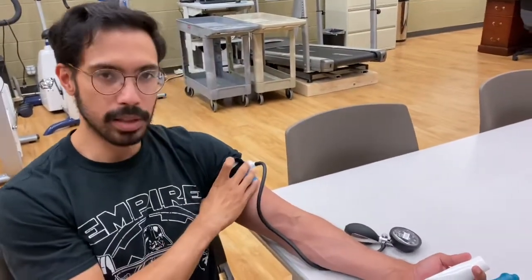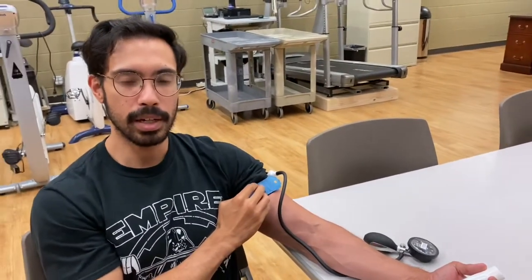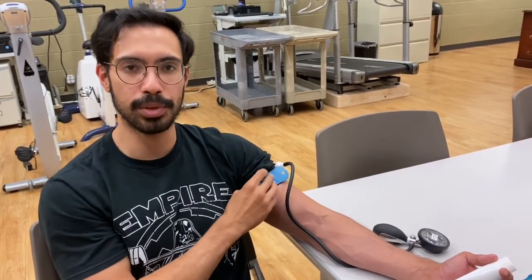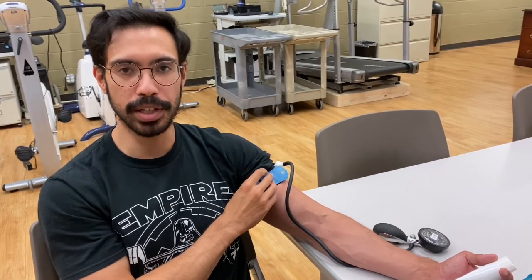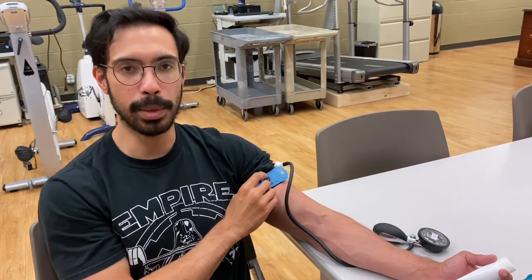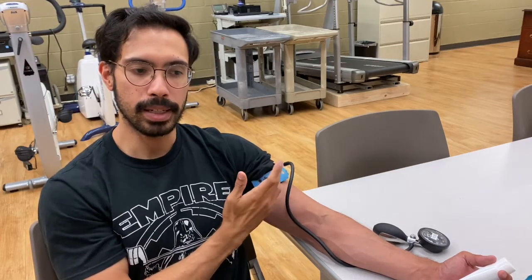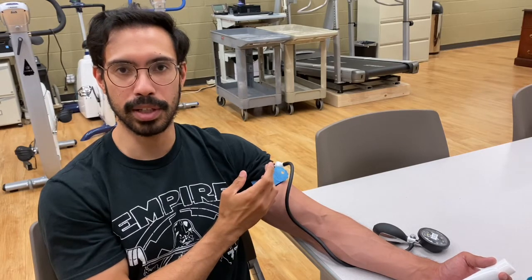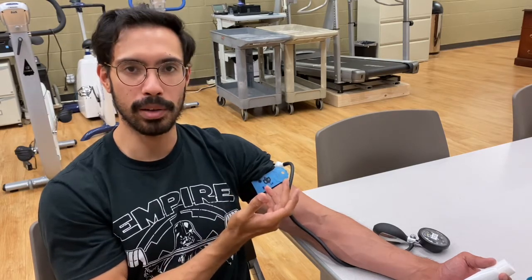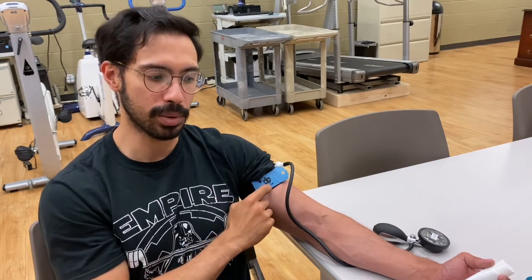So these are the bands that we're going to be using today, the BFR bands. These are the B3 bands. They're a narrow elastic band. They're a little in contrast to your typical tourniquet style wide rigid cuff that you would see in a blood pressure measuring scenario in your doctor's office. And a lot of the American products are also wide rigid cuffs. This is also an American product, but it's meant to mimic the narrow elastic types of bands that were originally used when BFR was first starting to come around, called the Kaatsu bands. It just means that they require a little bit more pressure to find that point, that AOP, which is the point where all the blood flow is cut off.